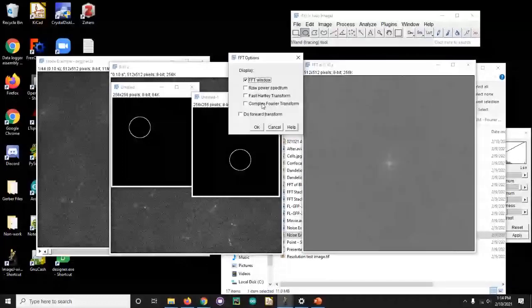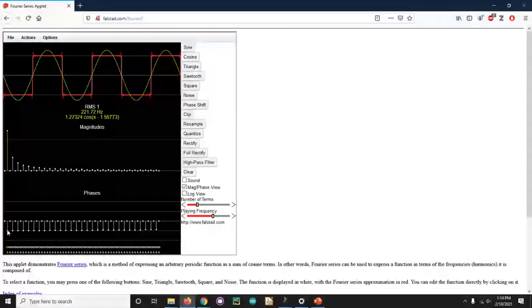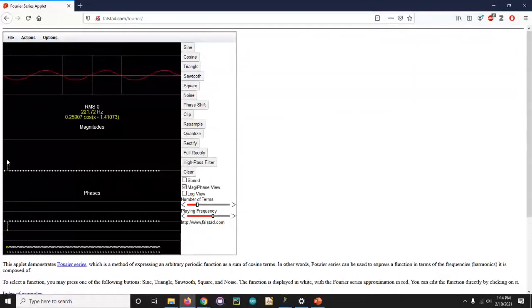So the other piece you need, should we actually go back here, so you can go to mag phase view, is the phase, right? So the phase, you can see as we change the phase, so I'll actually clear this, right? So if you take any given sine wave, the phase translates that sine wave side to side. So effectively, phase encodes the position of that sine wave. But the problem is it's not that intuitive. It's not like if I phase so much to the left, that's where the object was, because the phase is a function of the position, right?